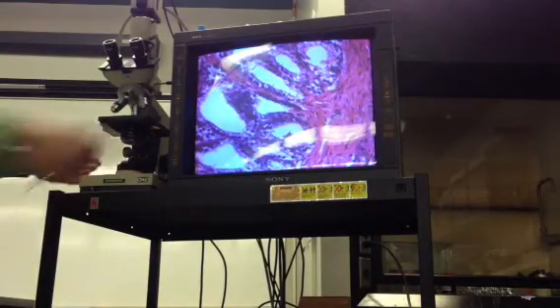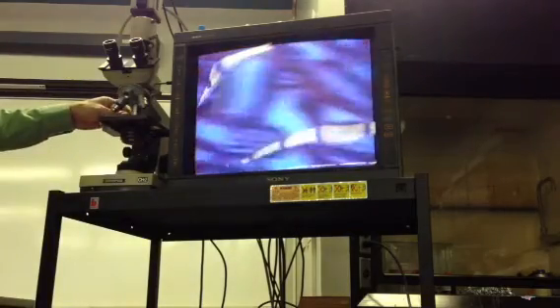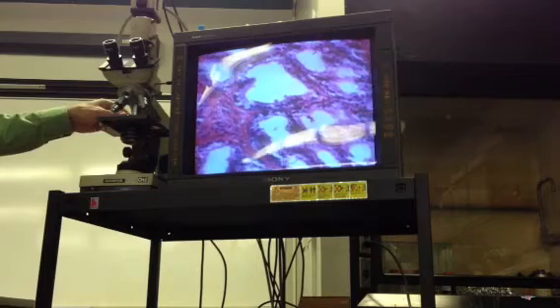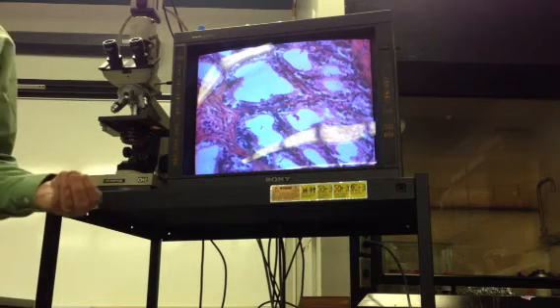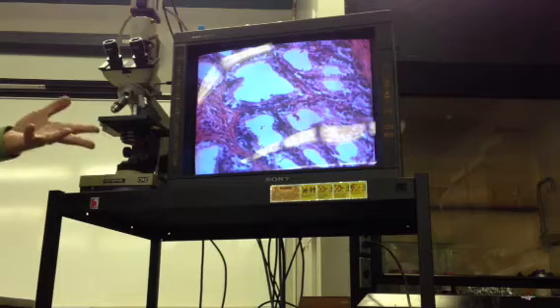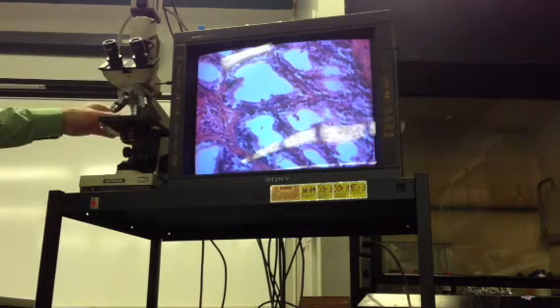although you have a lot of these glandular lumens here in the seminal vesicle, there is very little tissue between them, right? Whereas in the prostate, you have a lot of stromal tissue, mainly smooth muscle. Here you have just a little. And no sperm.